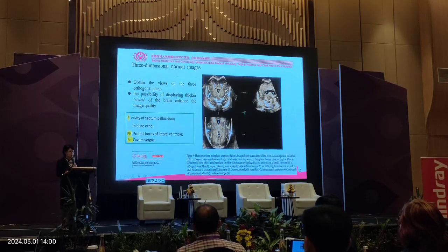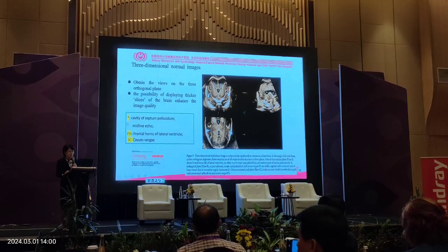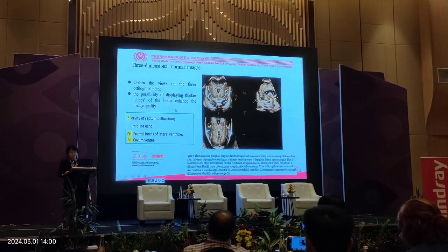And because it's a sliced section, we can see the cavum vergae here. So this can enhance the image quality.